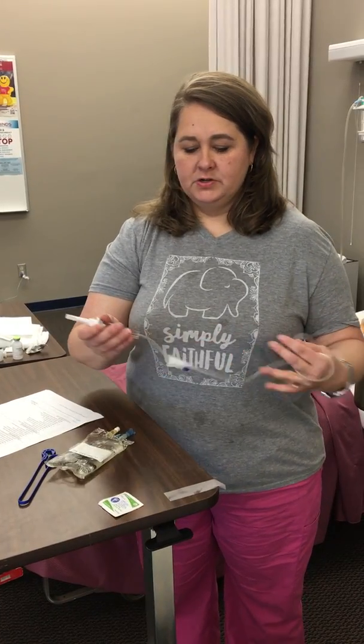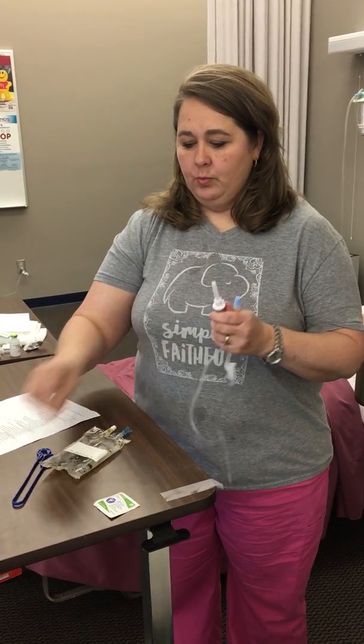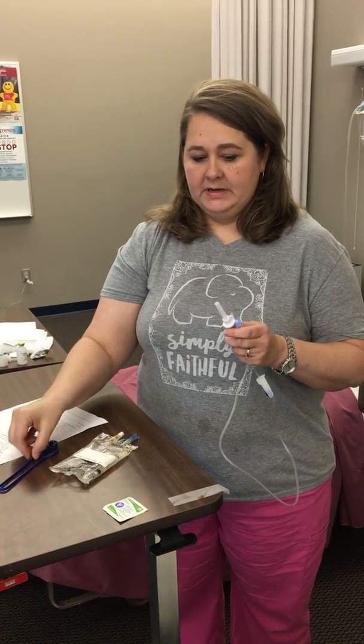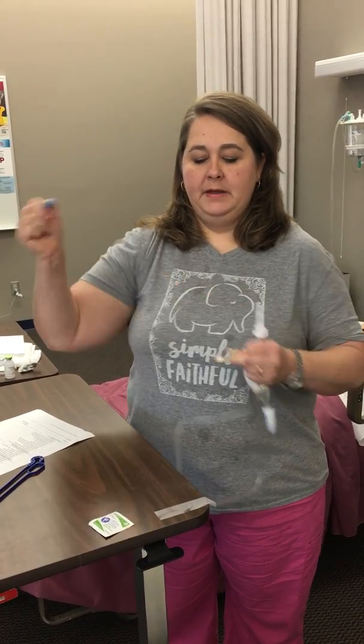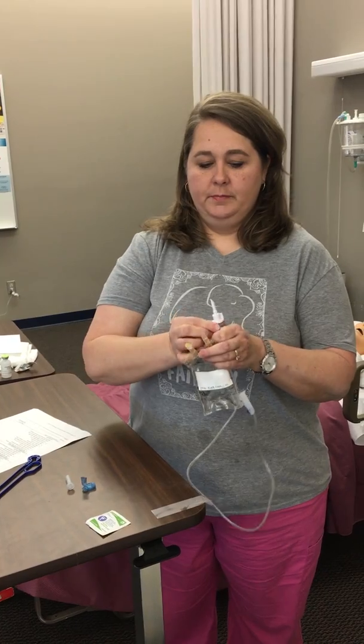Before I get to my patient's room I want to go ahead and prime my secondary tubing. Secondary tubing is a little bit shorter than our primary tubing, and we also have this little blue hook attachment that we need to take with us. I'm going to go ahead and remove the cap from my piggyback bag — this is a brand new bag for demonstration purposes.